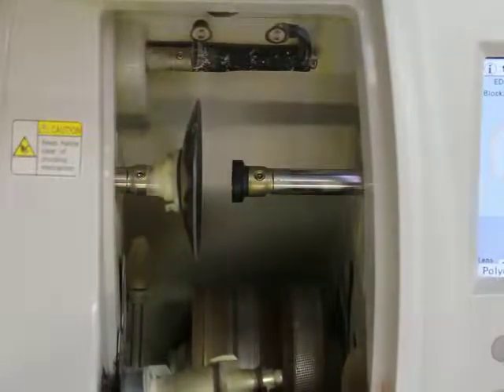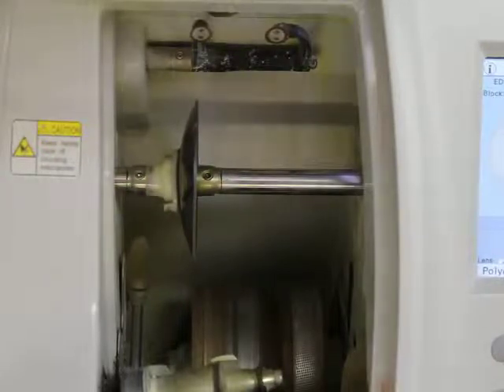Okay, here we are again. Today, Don Manning from Design for Vision, and we're going to cut a polycarbonate lens into a Ray-Ban frame.